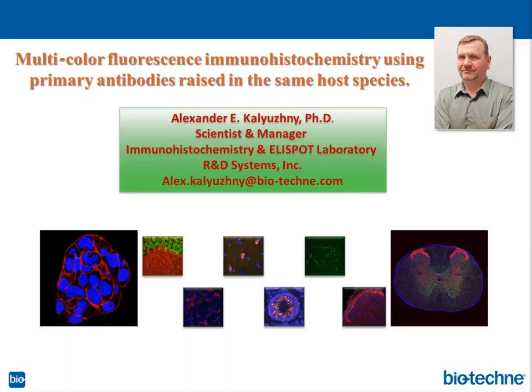There's a paper published using Sudan black B dye to stain tissues before you do staining with the fluorescent detection reagents. Sudan black B is a conventional, common histological dye used to stain lipids in tissue. And somehow when it stains, it blocks endogenous fluorescence. People use it, and it may work in your case. It's easy to do. I don't have a recipe in front of me, but you can easily find it, like I said, if you Google and search PubMed.